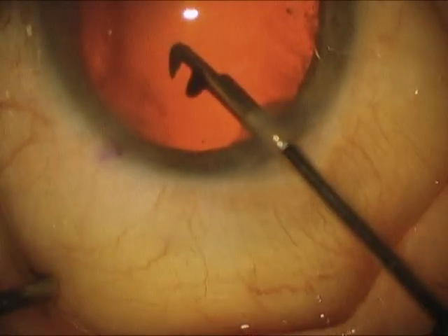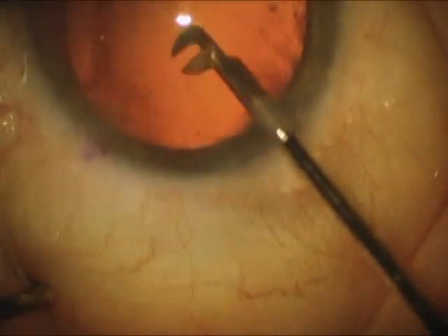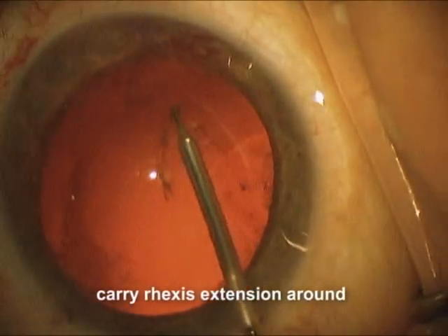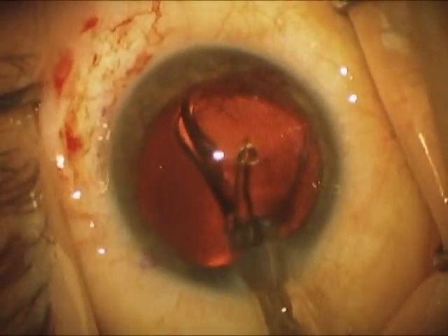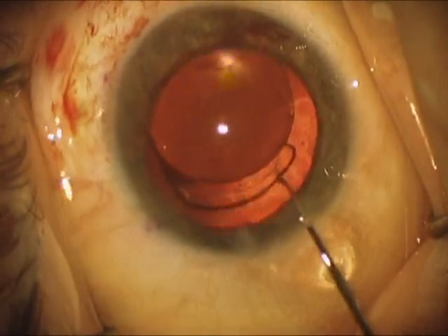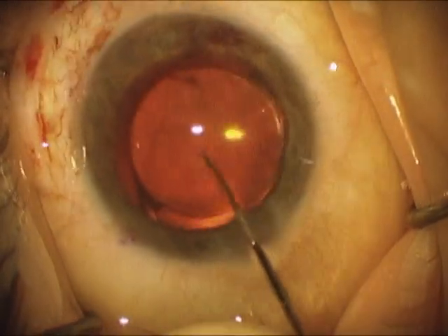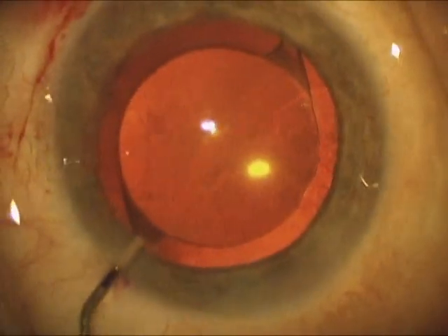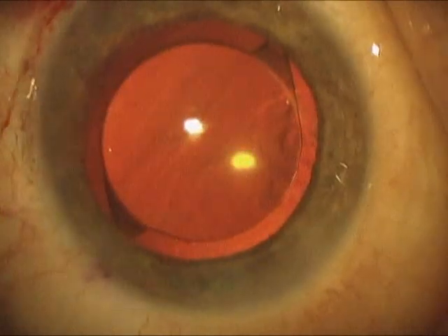Now we've got that all squared away. We're going to try to make the rhexis a little bigger — it was de-centered, which is common in these cases, as after you center up the bag you find out that the original rhexis was de-centered. We're going to use the duet forceps to make a more centered rhexis. We're going to place a single piece acrylic lens in the bag, which is actually quite stable by this point. The lens is nice and centered and seems quite secure. We're going to place some Miochol — didn't notice any vitreous coming around. Removed some of the viscoelastic material. So far, so good.